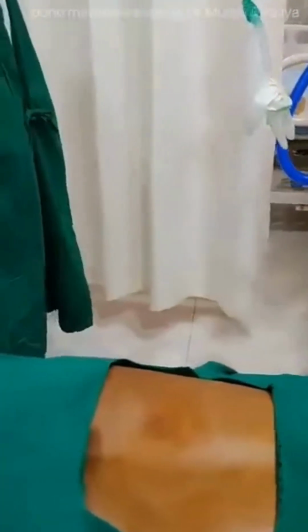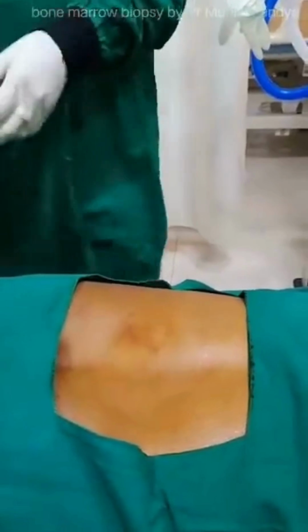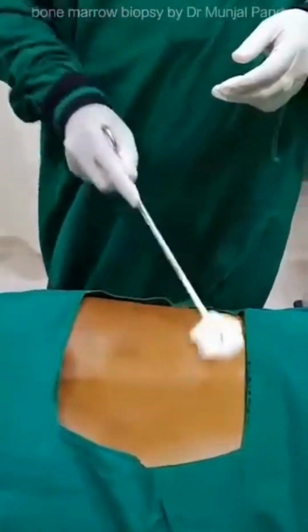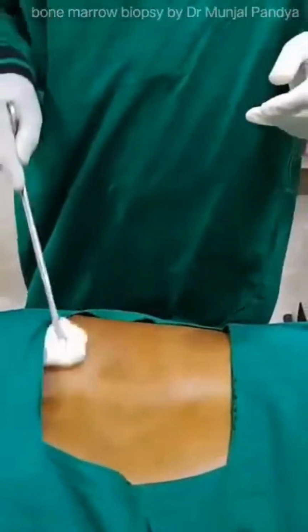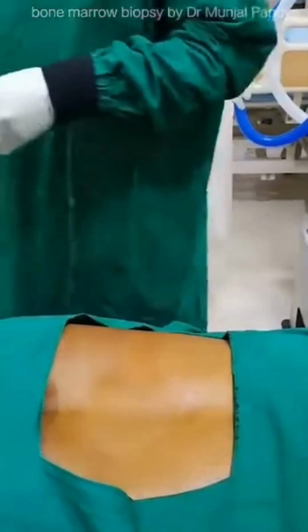Now I will guide you how to go stepwise to do the bone marrow. So now we are sterilizing the local area from where we are going to perform the bone marrow biopsy. So now we have done with this part.